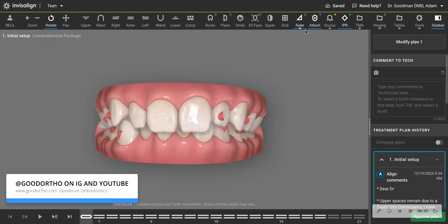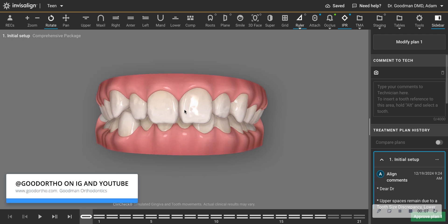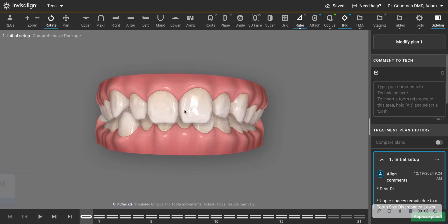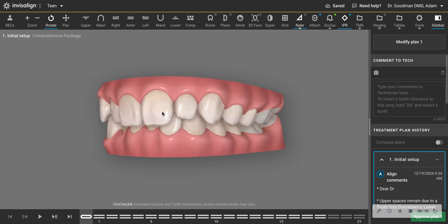I talk often about the difference between tipping and translation and favoring tipping movements with aligners for various reasons. And one of them is predictability and actually relating to the diagnosis in a case like I'm going to show you right now.